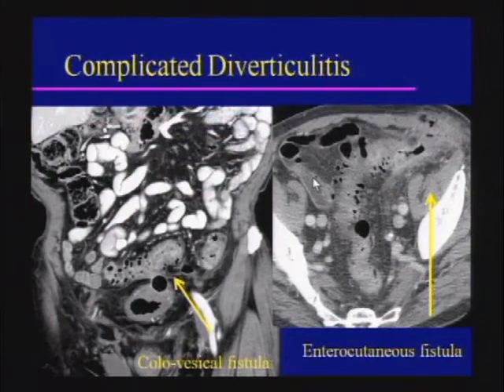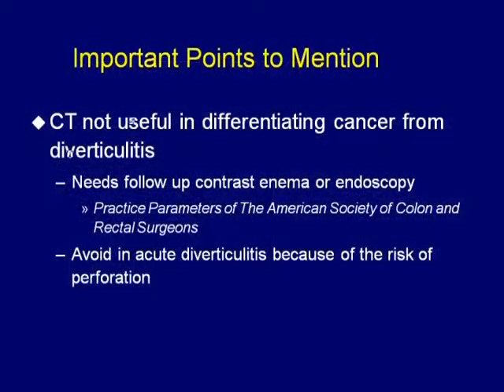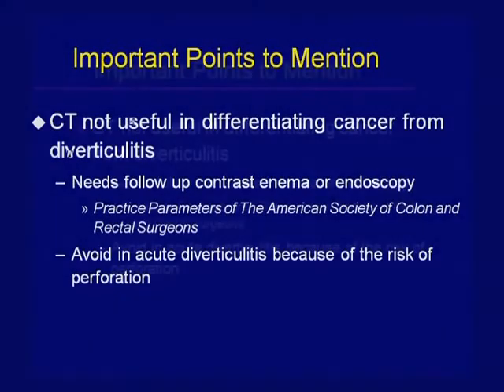In complicated diverticulitis, look for potential fistulae. There is an obvious colovesical fistula with a thickened sigmoid and multiple diverticula, and here a tract extends to the skin representing an enterocutaneous fistula. When you have diverticulitis, mention that CT is not useful in differentiating cancer from diverticulitis — these patients need follow-up contrast enemas or endoscopy. Avoid invasive procedures or endoscopy during the acute presentation due to the risk of perforation; wait until symptoms have resolved.